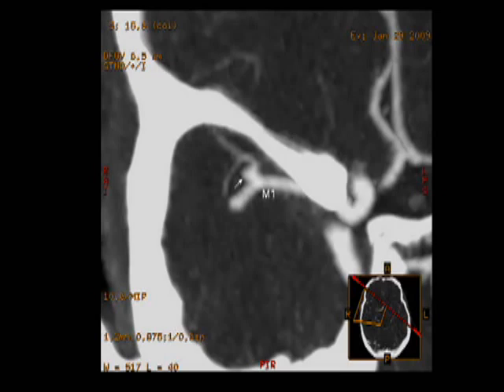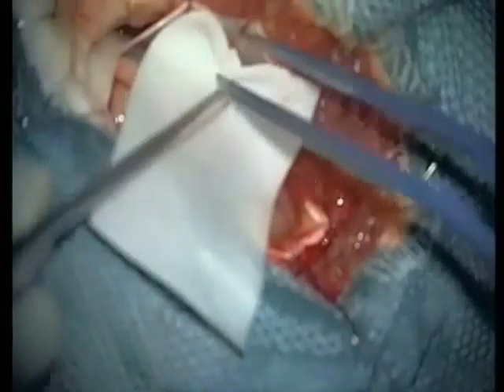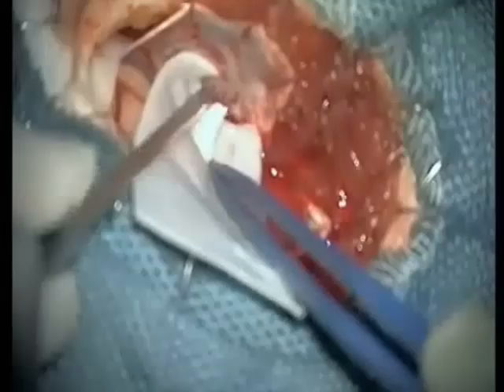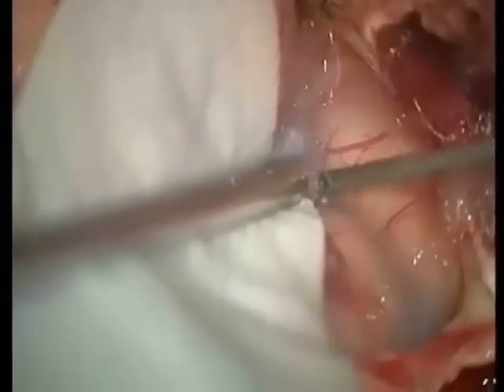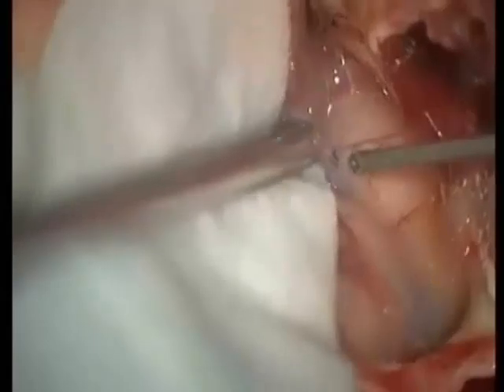In the surgical projection, the aneurysm will be pointing distally into the sylvian fissure, and it should not be obstructed by any other structures. The optimal approach in this case will be from distal to proximal along the M1 segment. Proximal control should not be a problem in this case.